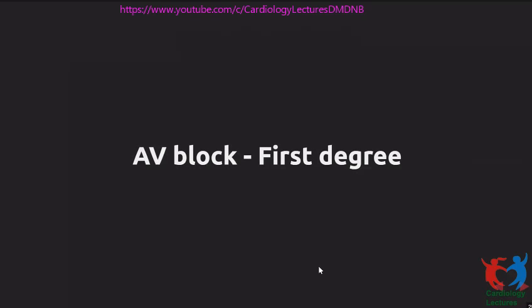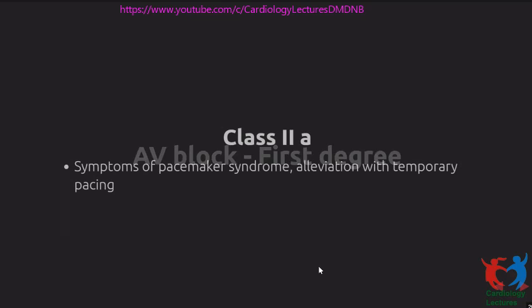Now, we discussed third degree AV block and second degree AV block. Is there any indication to pace first degree AV block? Usually no. 99% of patients with a first degree AV block do not need to be paced. A rare indication to pace is what is called pseudo pacemaker syndrome, or when you have symptoms of pacemaker syndrome. So the indication as per the AHA is if you have symptoms of pacemaker syndrome in association with a first degree AV block with alleviation with temporary pacing. So what does this mean?